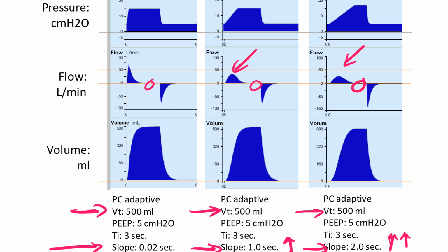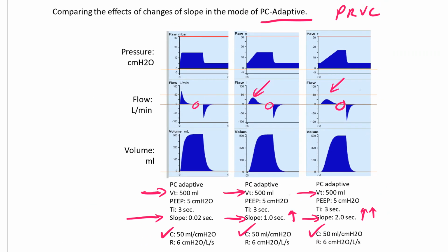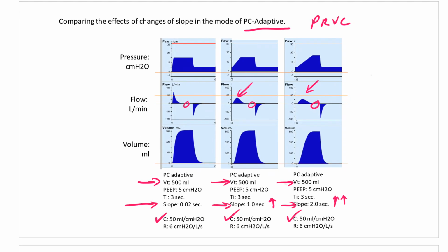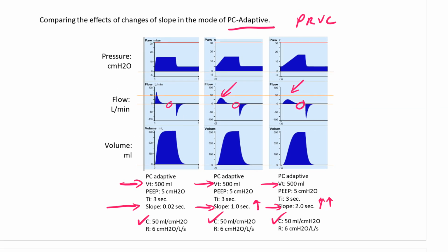And I'm making the assumption that there may be a relationship between peak inspiratory flows and shearing forces in the lungs. And of course, limiting that may reduce those shearing forces and reduce ventilator-induced lung injury. So I've given you another strategy here to limit peak inspiratory flows or mean inspiratory flows.